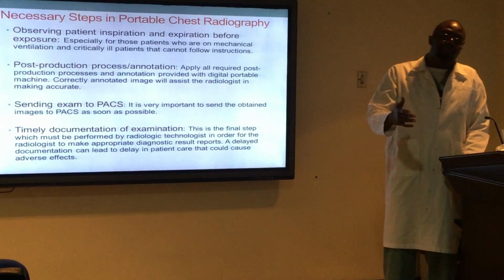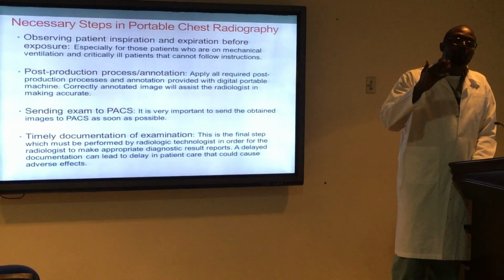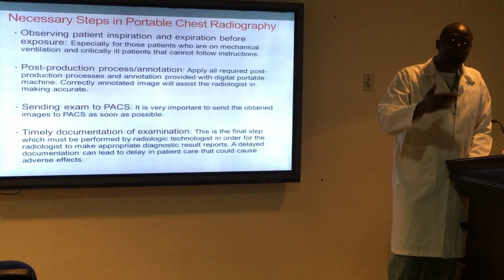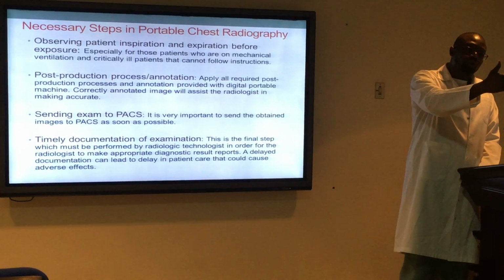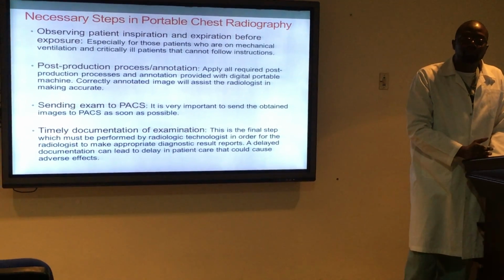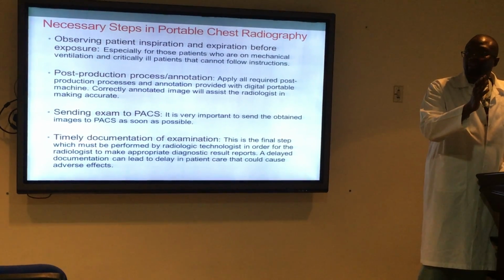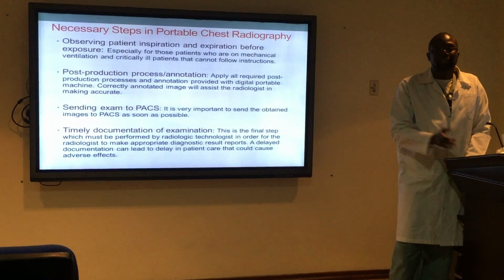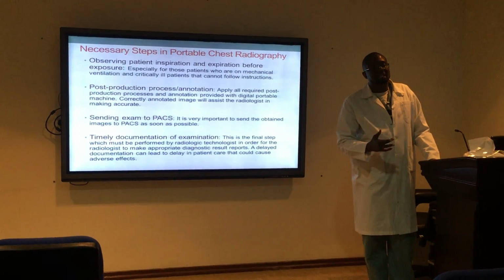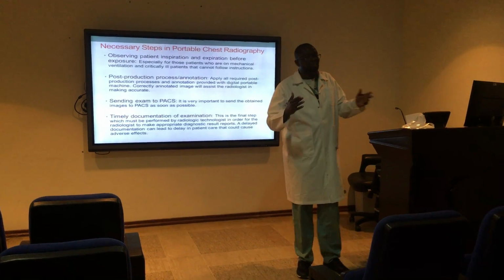A timely documentation helps the requesting physician to do the next thing they have to do with the patient. Delaying documentation could have an adverse effect on patient care. So we should try as much as possible to do our documentation as soon as possible.